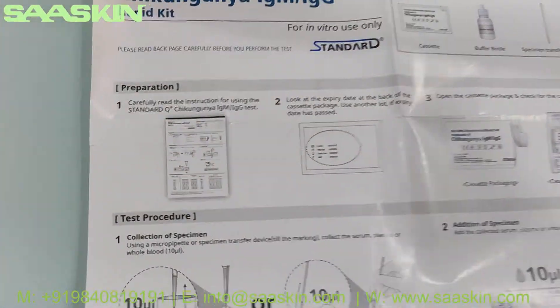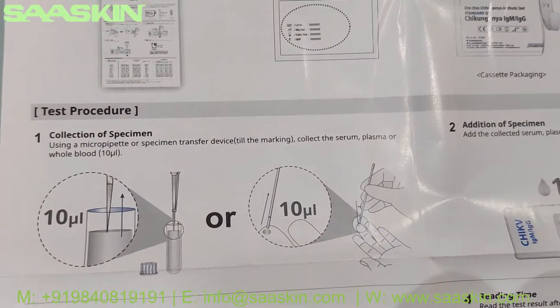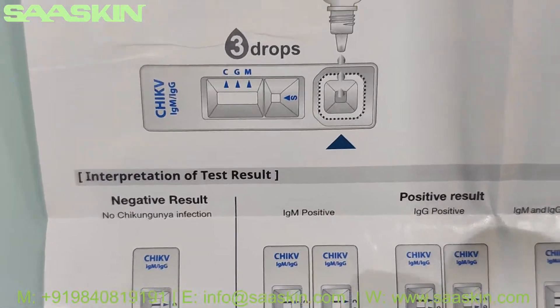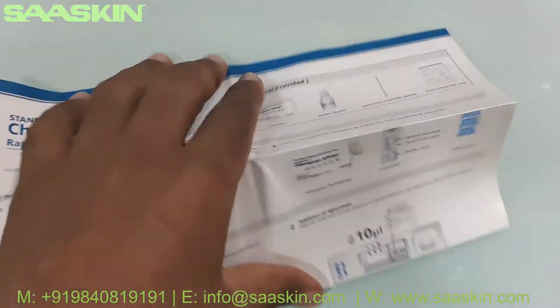This instruction for use is a standard practice — it talks about the preparation of samples, the testing procedure, and how to interpret the test results. It gives complete guidance for doing the test, from sample preparation all the way through completing the test.